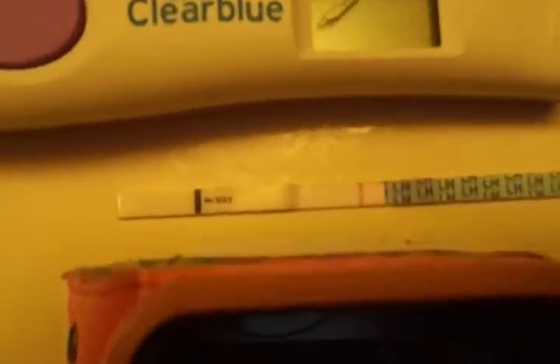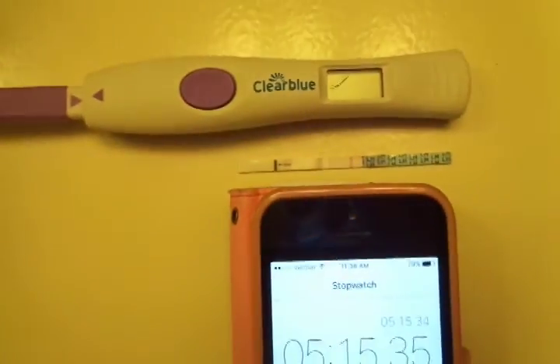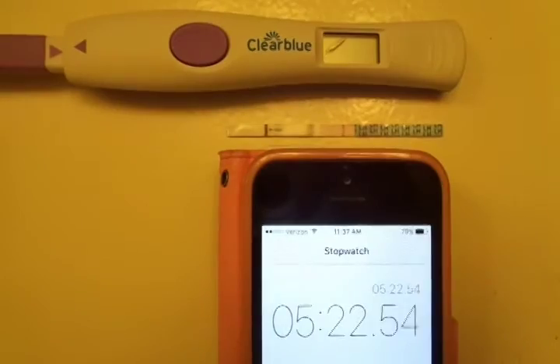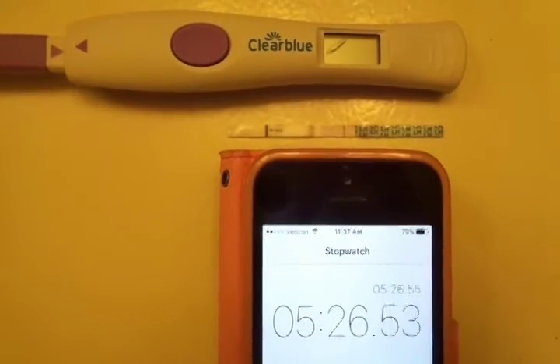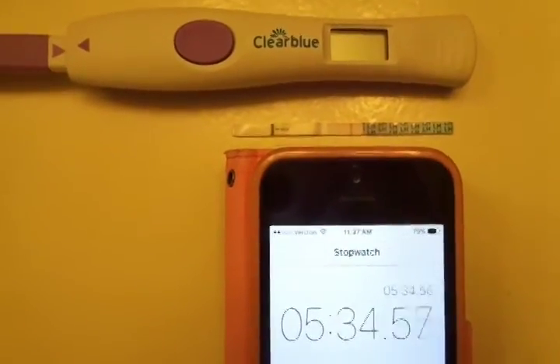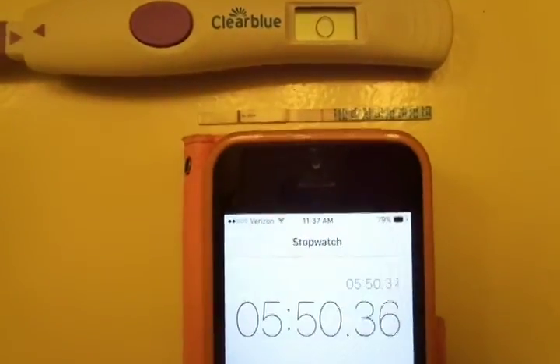Okay, it's at the 5-minute mark and the Wondfo is negative. The Clear Blue is still working. Okay, so the Clear Blue is negative. The Wondfo is negative.